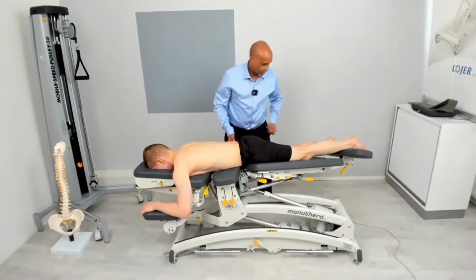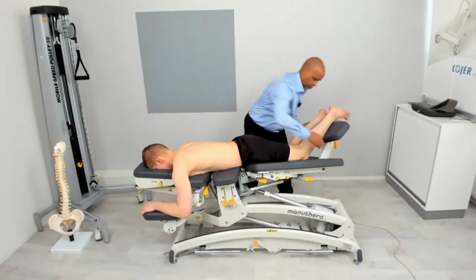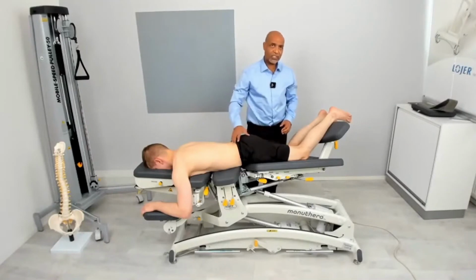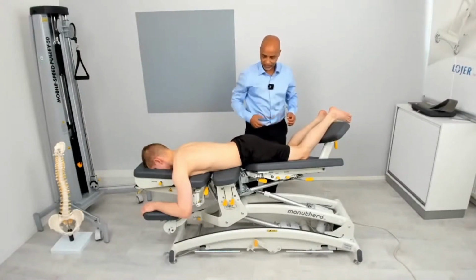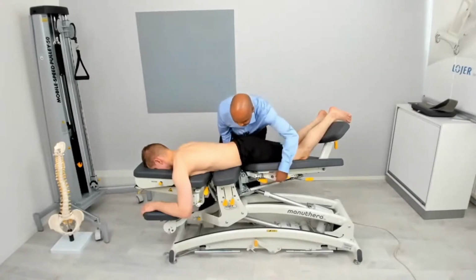So in this case now, I am going to lift up a little bit this to make sure, because remember when the person has a radiating pain, you have to be paying attention to the sciatic nerve irritation. By keeping the leg a little bit higher, that allows the sciatic nerve to be less tensed. So in this case now, I will activate the drop.